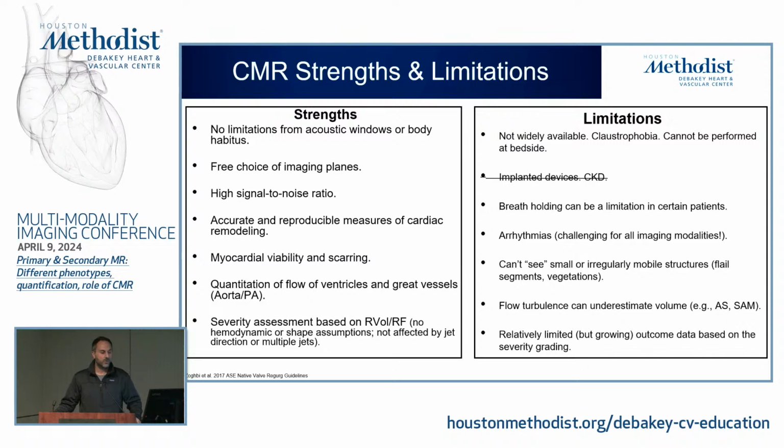Limitations, again: it's not widely available. Claustrophobia. It cannot be performed at bedside. Implanted devices and CKD are no longer an issue from a scanning standpoint, but implanted devices can affect the image quality, of course. Breath holding, as I said, can be an issue. Arrhythmias, but it's challenging for everyone. Again, we can't see the mechanism if it's an irregularly moving structure such as a flail or small vegetation. Flow turbulence can affect the flows, and the outcome data based on MRI is still limited, right? Because it's relatively new, but it's growing. All right, and that's it for me. Thank you.